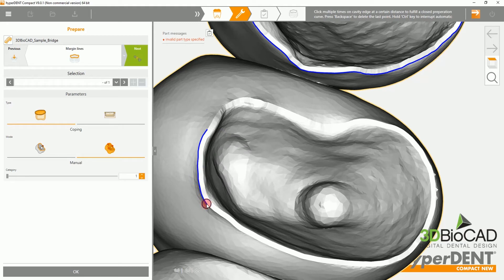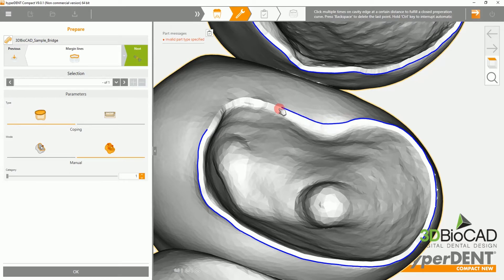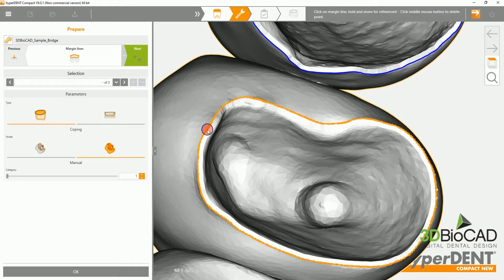Then zoom in to the margin and click and drag to draw out the margin line to your liking. Please remember to identify and select all of the margins in your milldrop file.